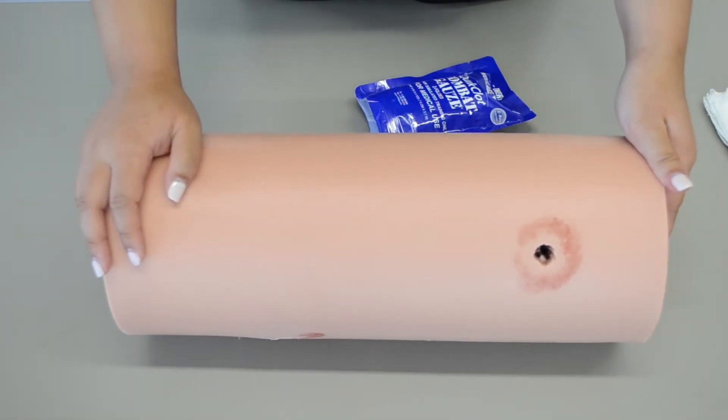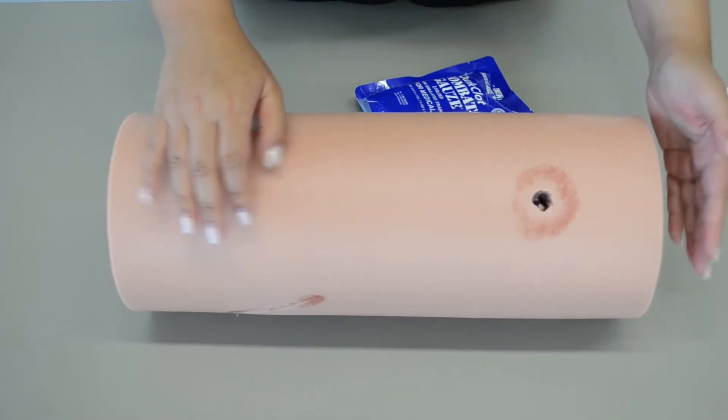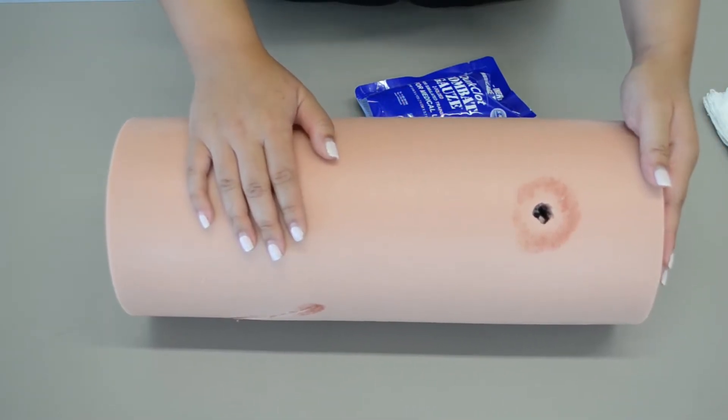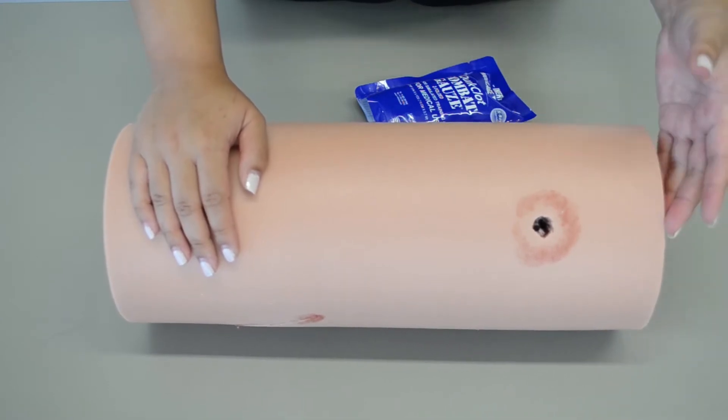Alright everybody, so we're going to be doing the combat gauze skill. This is going to be used on a life-threatening hemorrhage in the trauma patient when the tourniquet cannot be used, or to supplement the tourniquet.